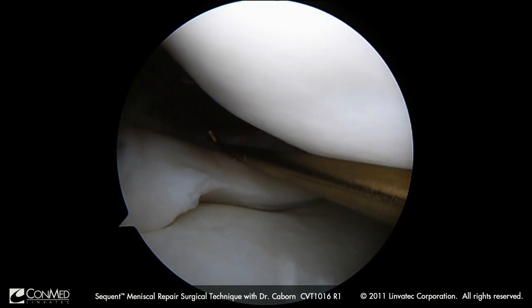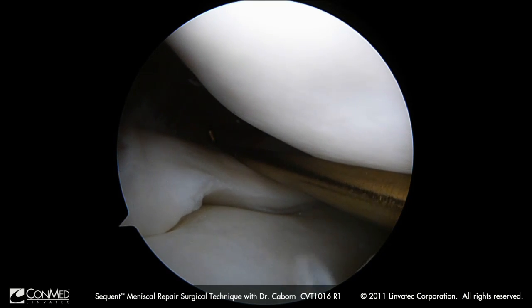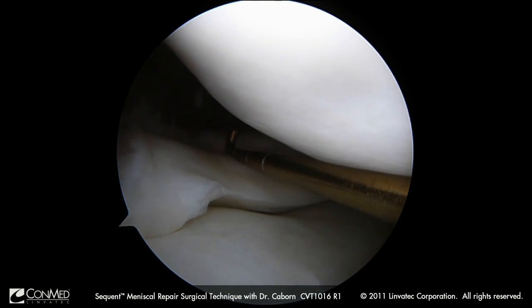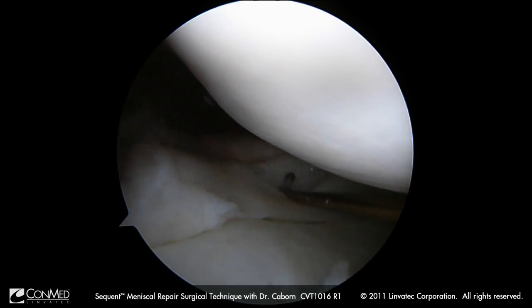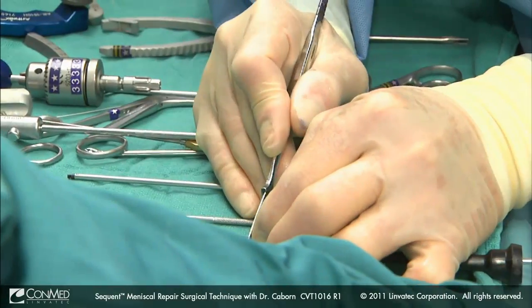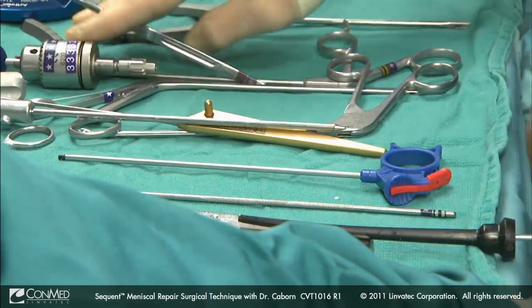Put your probe in here — how much am I going to need to allow me to penetrate and then deploy my implant cleanly, not into tissue. I am very comfortable cutting this to 2 cm, and I am cutting that at 2 — should be a nice clean cut.